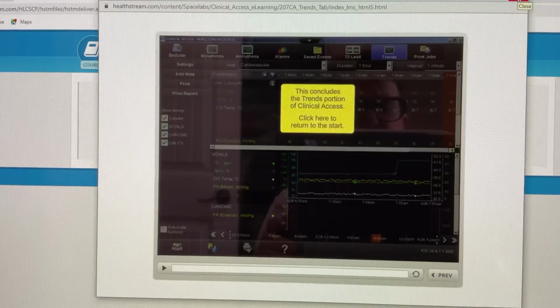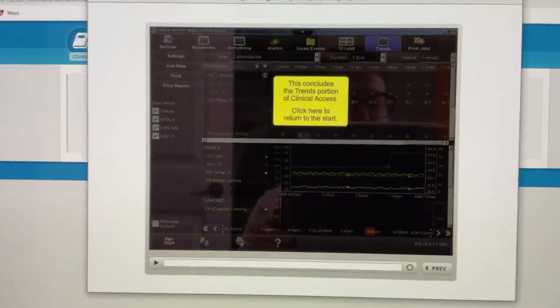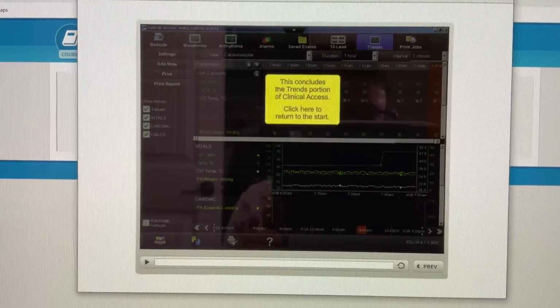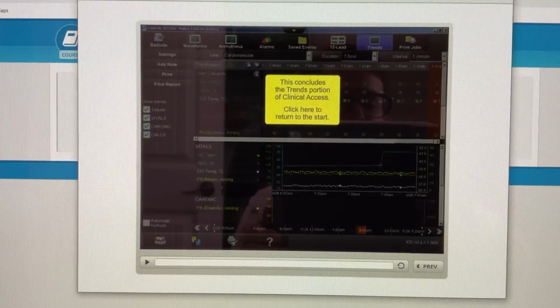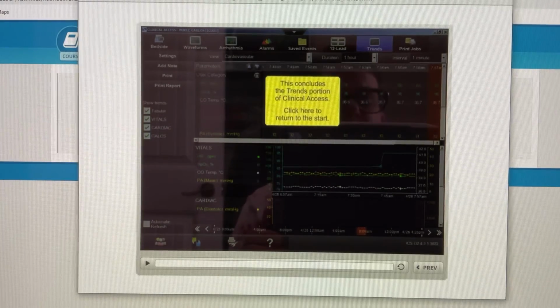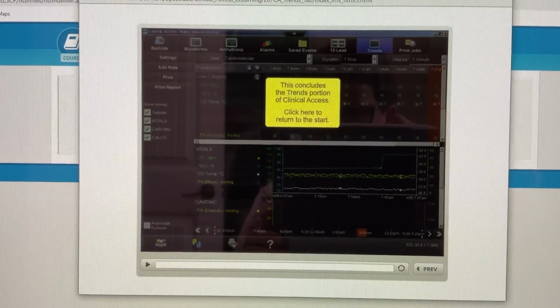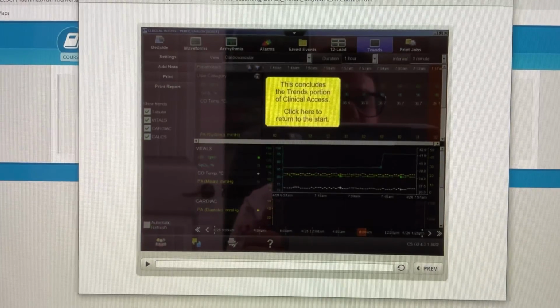What I want to bring to your attention is it is a nurse's responsibility to do an analyze and a strip measurement at the beginning and the middle of every shift. So somewhere between 7:30 and 8:30 in the morning and evening. Somewhere around 1:30 in the afternoon and 1:30 in the morning. If you're working an evening or a night shift, you're certainly going to assess the measurements and analyze your rhythm when you first come in to care for your patient.